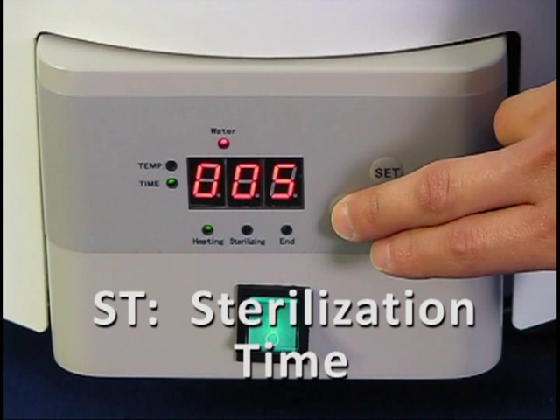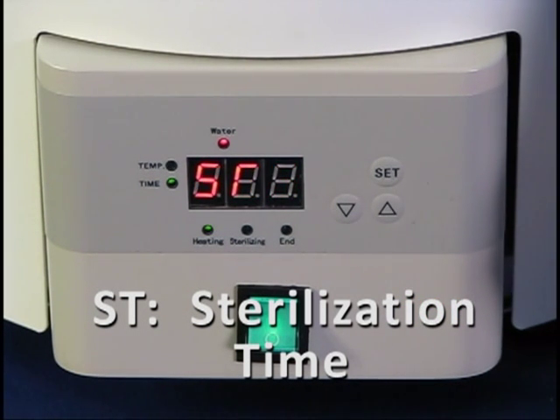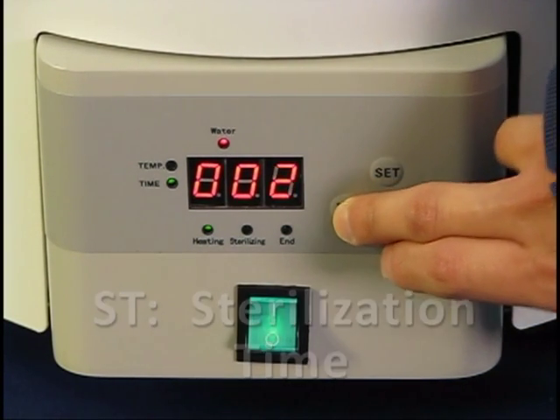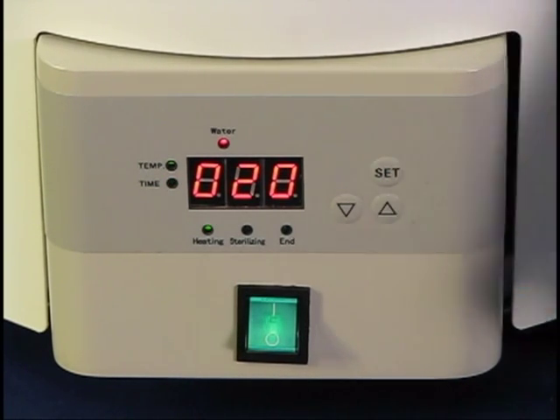ST will flash similar to SP, displaying the time in minutes. Enter your sterilization time with the arrow keys. Press SET to confirm your settings. Heating will begin immediately.